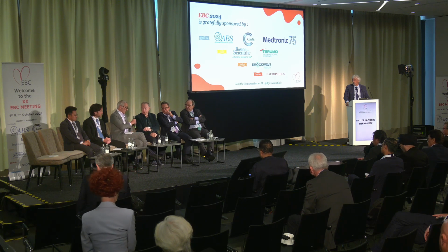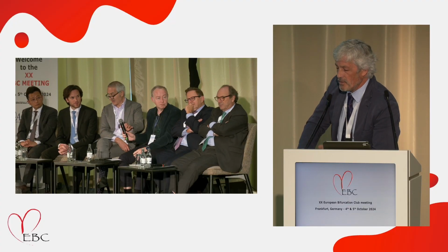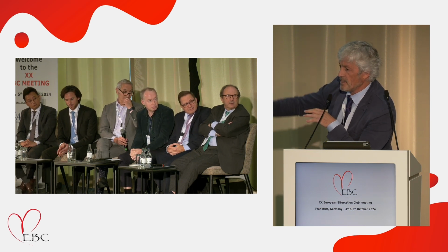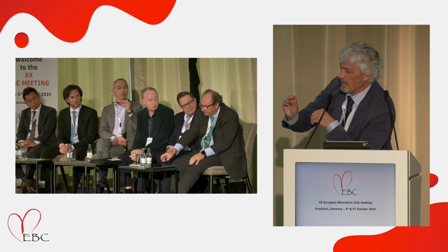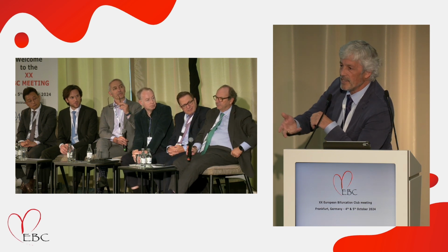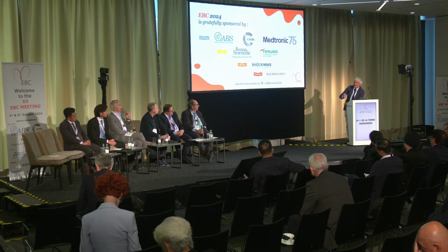Just a quick one, fantastic talk. What do you think about stent design in terms of 2-connector, 3-connector for this type of lesion? Do you think it has a difference, and also the platform stent to artery ratio? I think one of the issues concerning the treatment of osteal lesions, more aorto-osteal than these osteal lesions, but as well, is that we need platforms that have radial force. These lesions have recoil, and it's not uncommon to implant the stent, you see the full expansion of the balloon, you remove the balloon, then you do imaging, and you see the osteal with some expansion, small lumen. You post-dilate again, even with a larger balloon, the balloon is going up, you remove the balloon and the lumen is going down again.